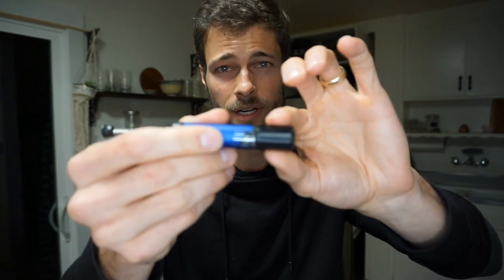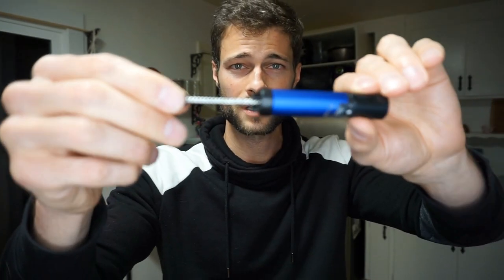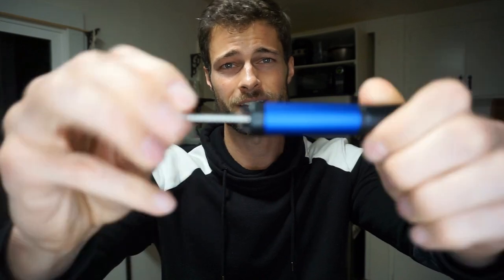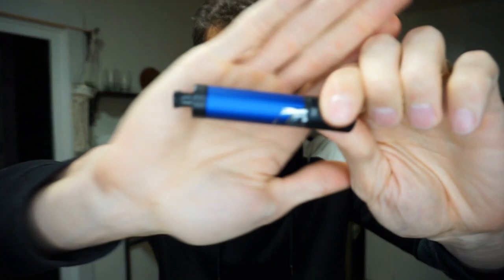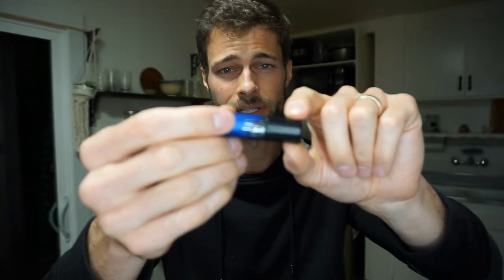Now we grab the plunger. Grab here on the end — you can hear it — make sure that's closed. Grab the end and grab this side as well. Turn counterclockwise — which for me is to the left — turn it all the way in so that it doesn't mess it up. It's a long way to twist. All the way in. Almost there — and the plunger before was out to here, now it's all the way back in, ready to go.